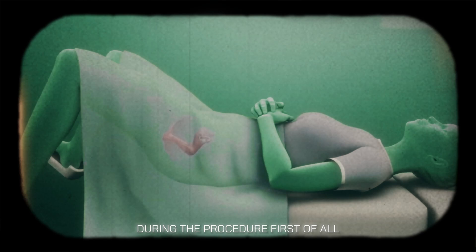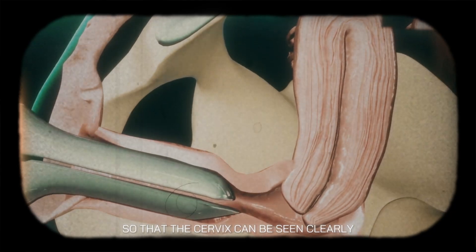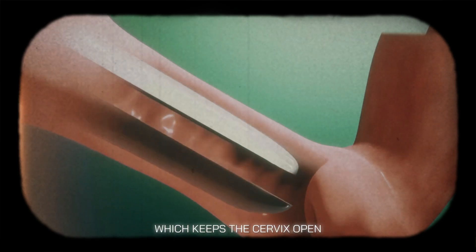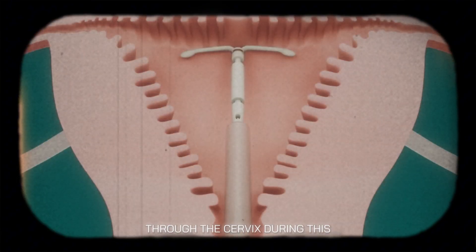During the procedure, first of all, you are made to lie down on the patient bed. After this, the doctor uses a speculum so that the cervix can be seen clearly. The speculum is inserted inside the vagina, which keeps the cervix open. Then, with the help of a special inserter, the IUD is carefully inserted inside the uterus through the cervix.